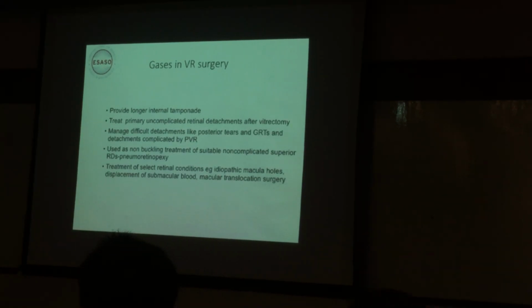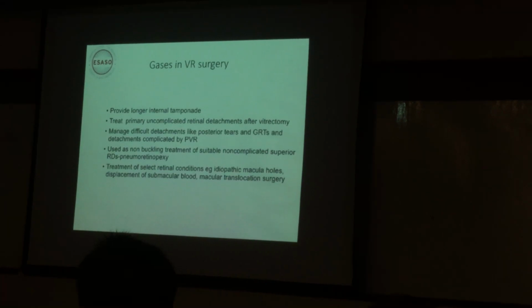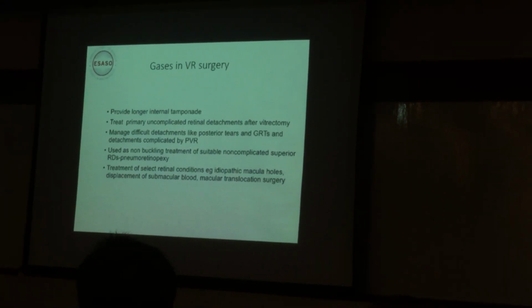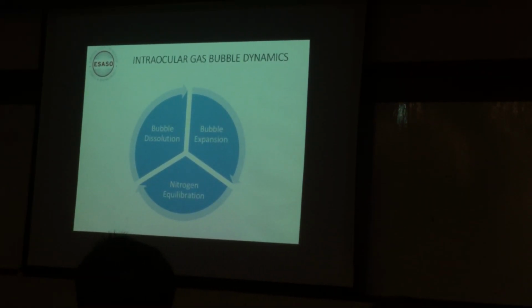of PVR. So it is also used as a non-buckling treatment of suitable non-complicated superior retinal detachments, for example in pneumoretinopexy. Okay, and of course, because nowadays we do macular surgery, it is also useful to treat select retinal conditions, for example, macular holes. We need to put gas to seal, to close the holes as well. So the dynamics is very important.